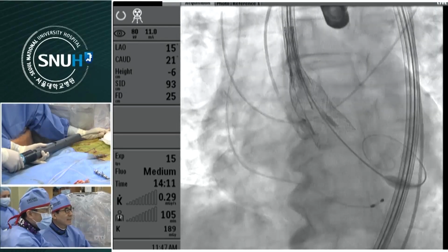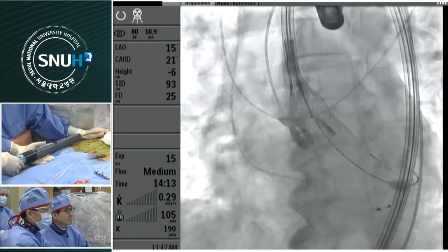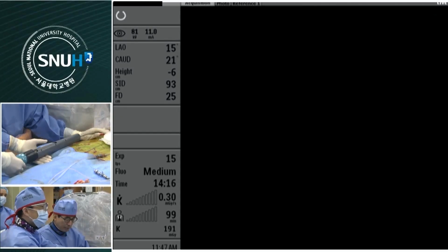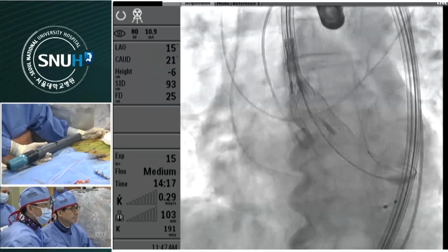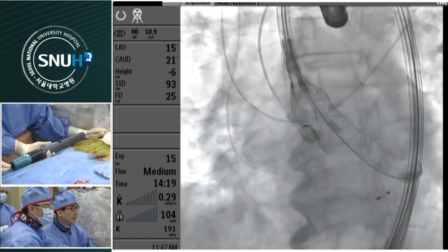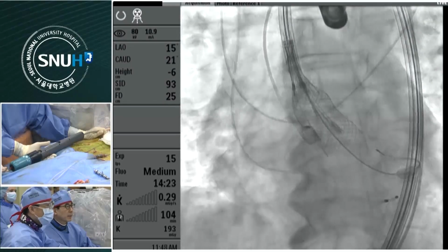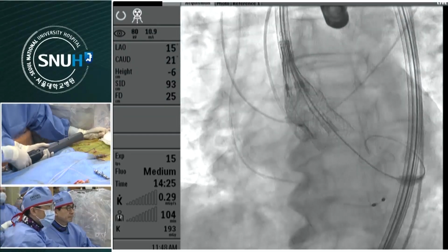Maybe you can do the overlay around here. Test. So far, it's good. Go ahead. Then I perform overlay by pushing and holding the system. And in the final little bit of deployment, there is some shortening of the lotus valve. Deploy.